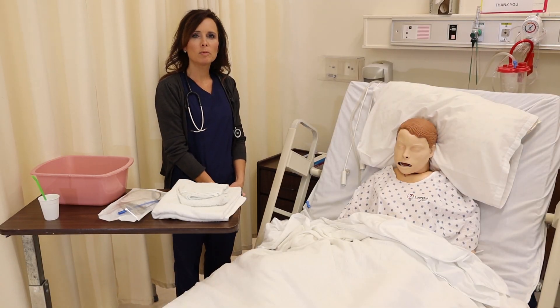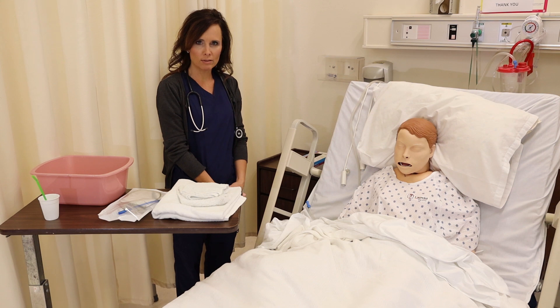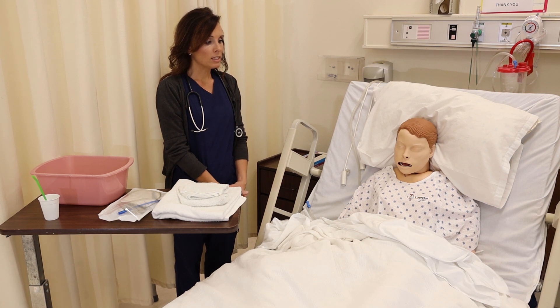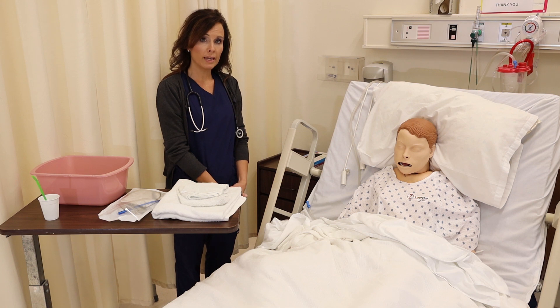Hello, I'm Ms. Socorra and I'm going to be going over your NG tube placement skill today. The first thing we're going to do is check our order for the client to have an NG tube. We're also going to make sure we look at if it's to be to suction or if it's to be clamped, and what amount of suction should be applied.